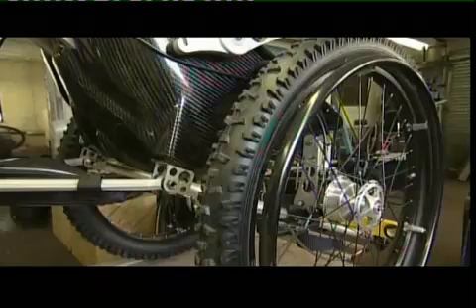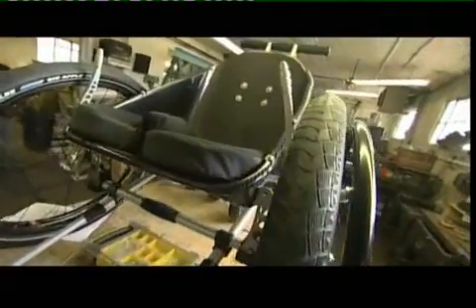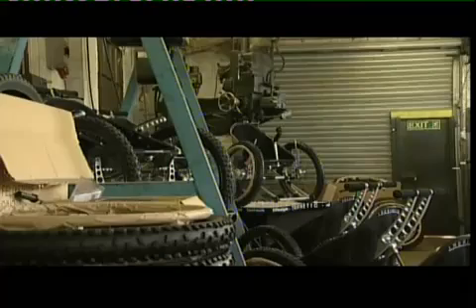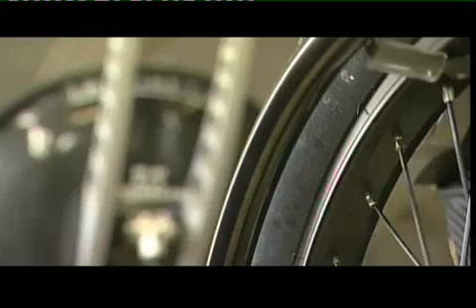In 2003, Mike finally felt the Trekinetic was ready to unveil. He invited a group of wheelchair users to the Aspire Centre in Stanmore to take a look. Mike's unusual three-wheel design had borrowed from Formula 1 technology to create a lightweight, carbon fibre monocoque seat, which was curved for comfort. Initial responses to the wheelchair were positive.